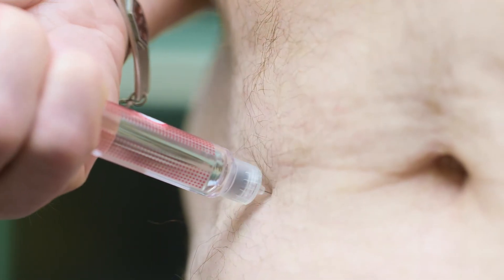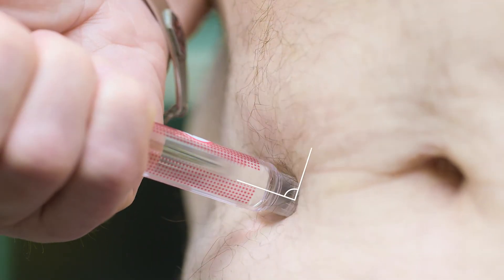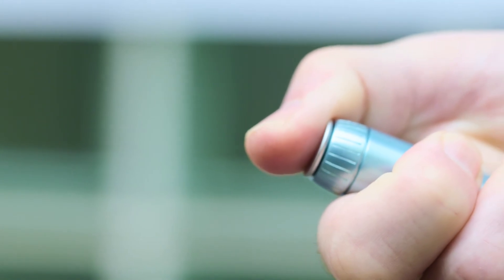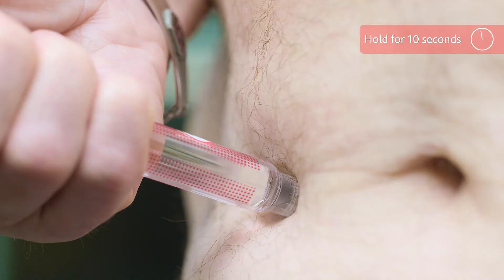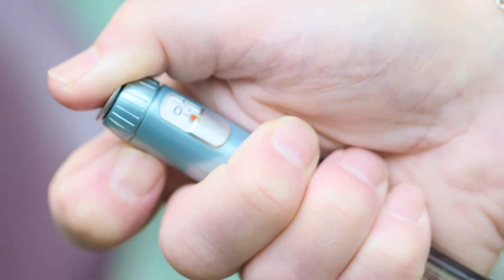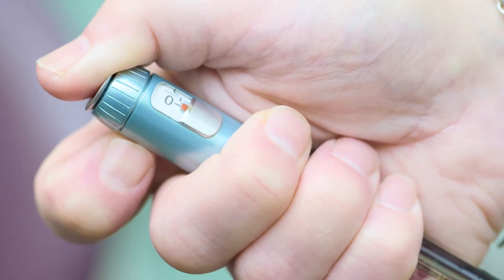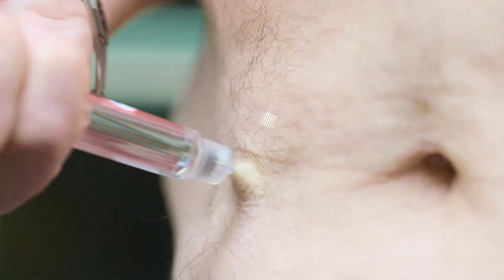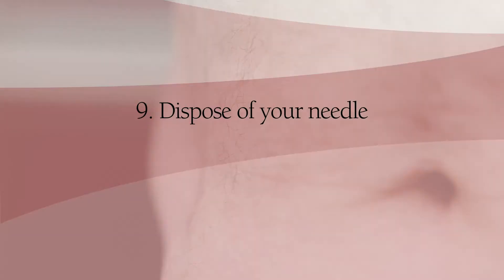Now for the injection. Put the pen straight — not on an angle — into your skin. Press the injection button all the way in. Keep holding it and slowly count to 10. Then check the dose window again to make sure that it shows zero. This means that all the insulin is injected. Pull the needle out straight and that's it.